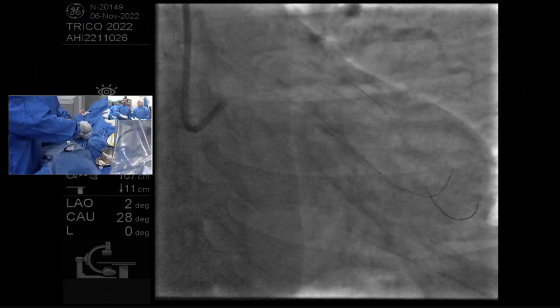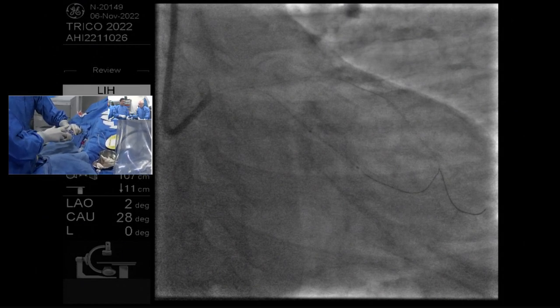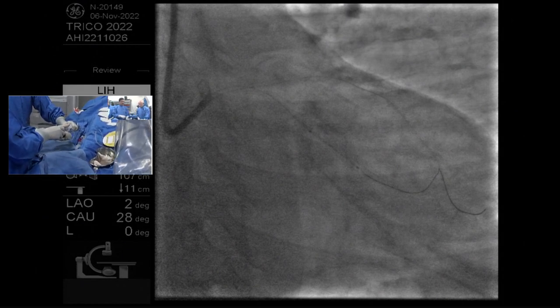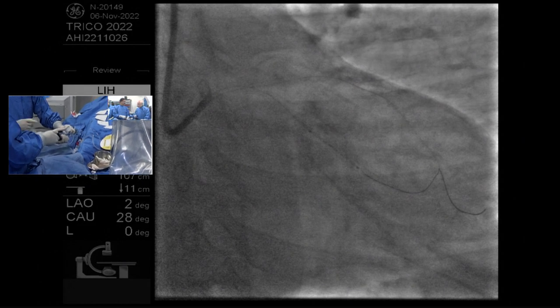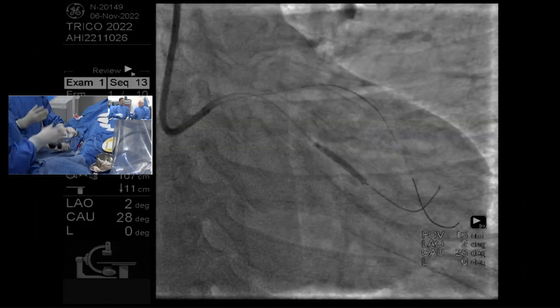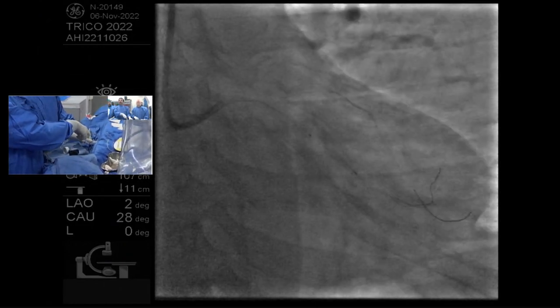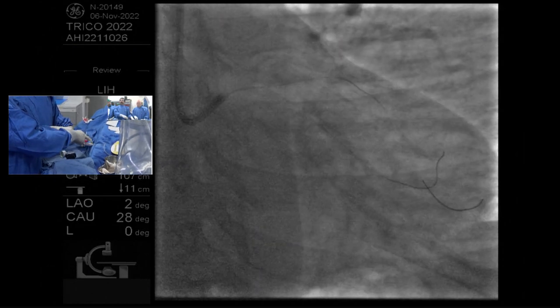Professor Akasaka here, and we really need to do some imaging, right? Once we do imaging, lots of questions will be answered. I think Professor Malik's point is very well taken. So why guess? Why guess when you can get the imaging and get the result that's tailored to that vessel, particularly when you're going to have to pull the imaging out for the left main and the LAD.